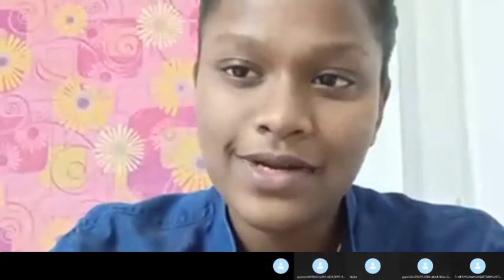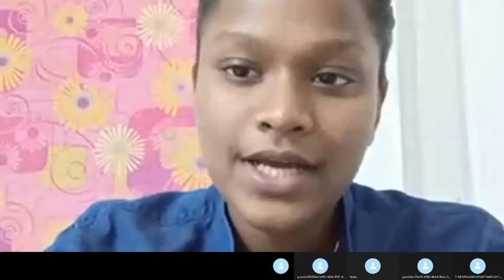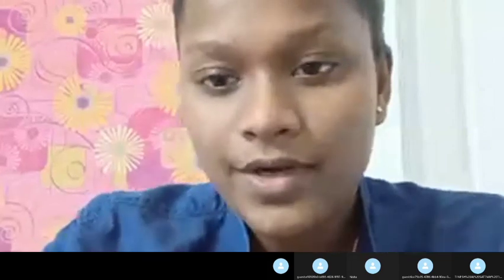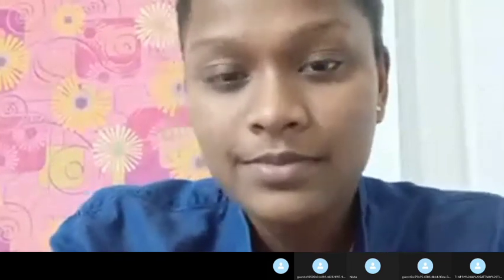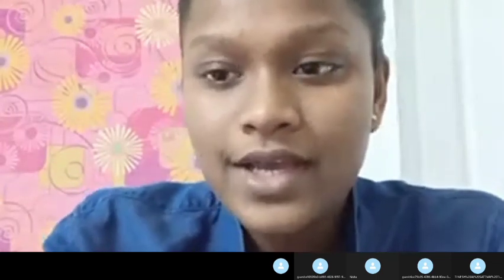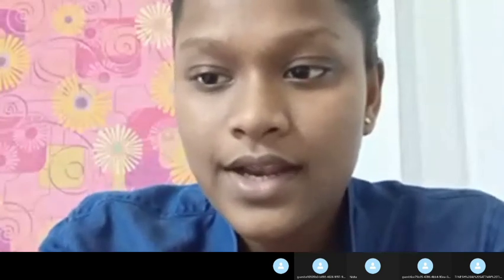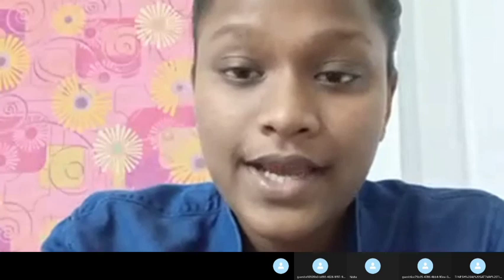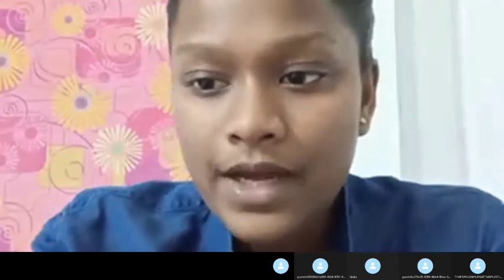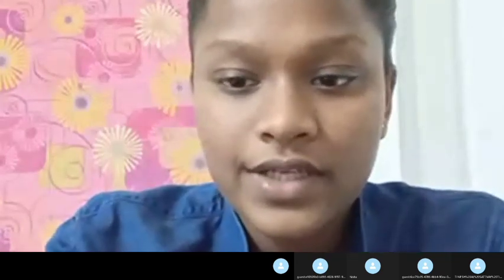I'm going to present about possible diagnosis conducted on blood culture and sensitivity, urine culture, throat swab, sputum culture and sensitivity. First of all, I'm going to explain about the blood culture. Blood culture testing is used to identify blood infection that can lead to sepsis, a serious and life-threatening complication. Second is urine culture. This test can find and identify the germs that cause urinary tract infection.